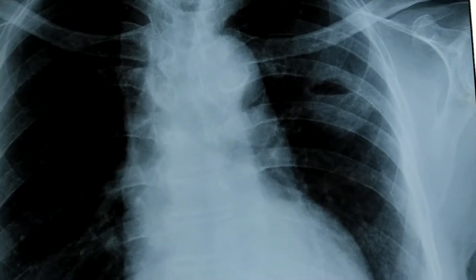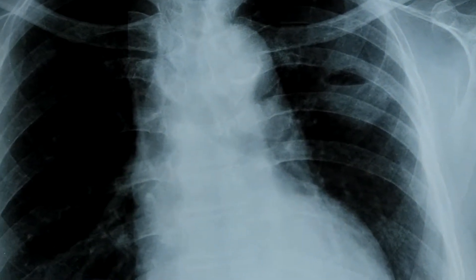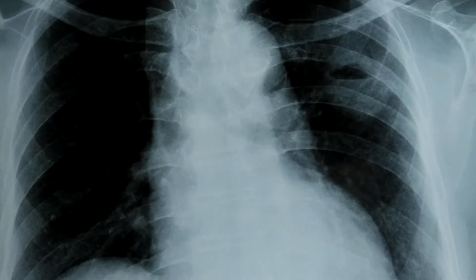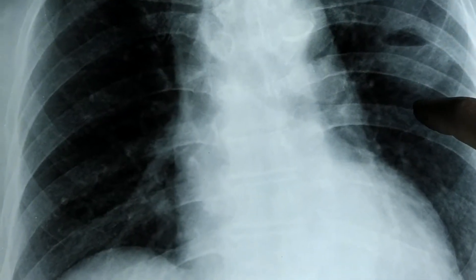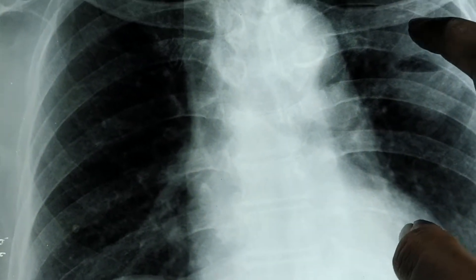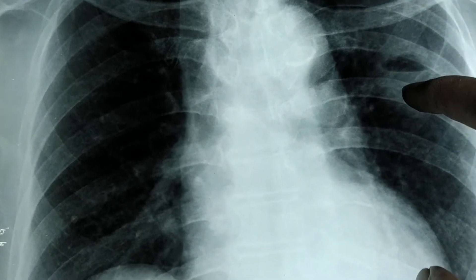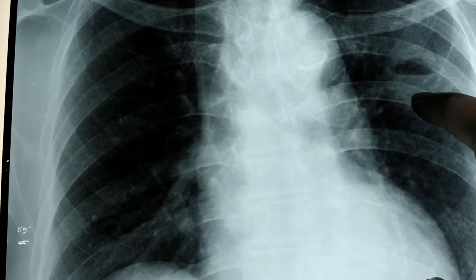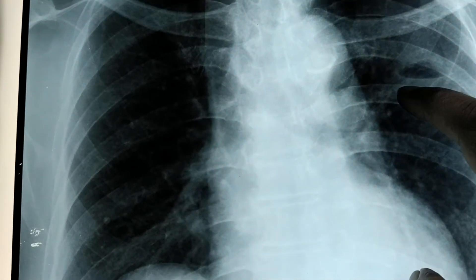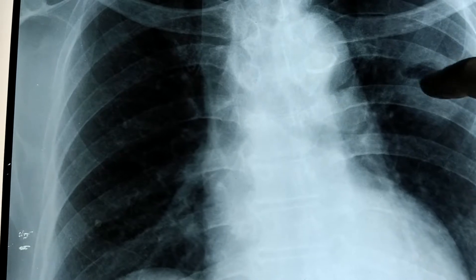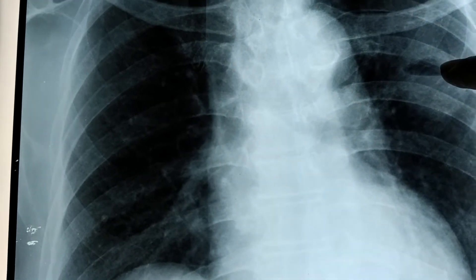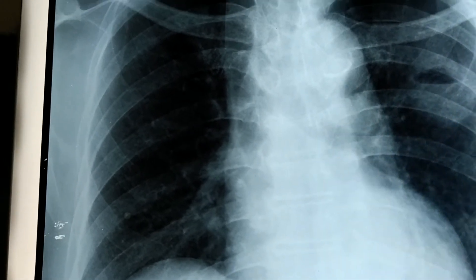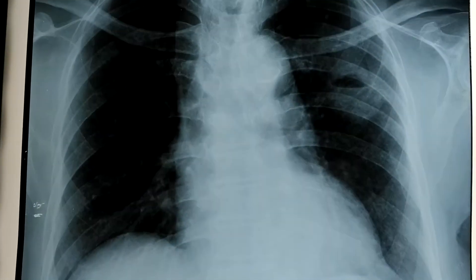There is a well-circumscribed radiopaque shadow involving the mid zone of the left lung field. Look very carefully — this is the abscess cavity. Below the radiopaque shadow is a radiolucent area, which is due to the gas produced by gas-producing organisms that caused this lung abscess.